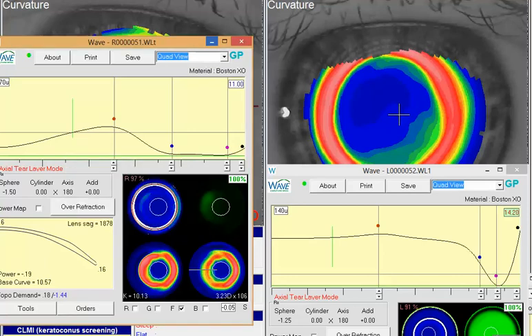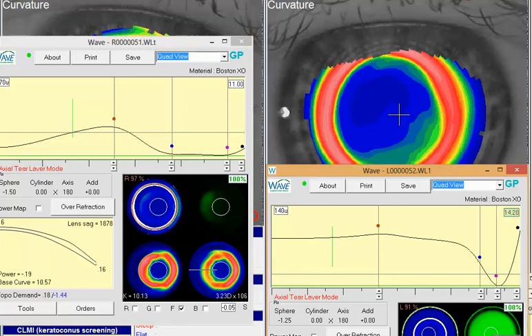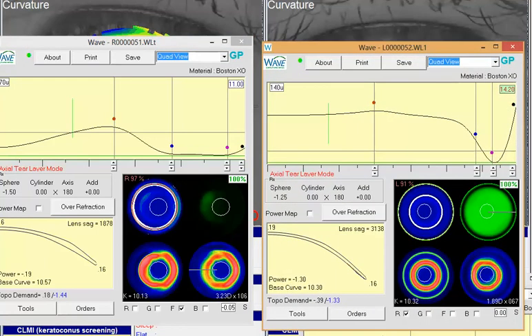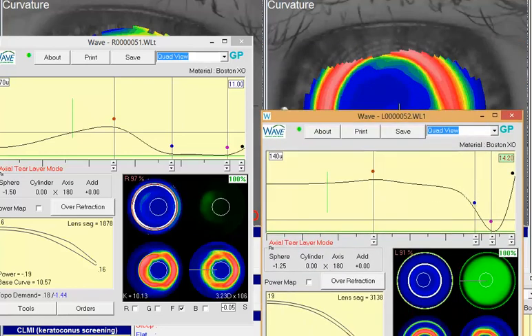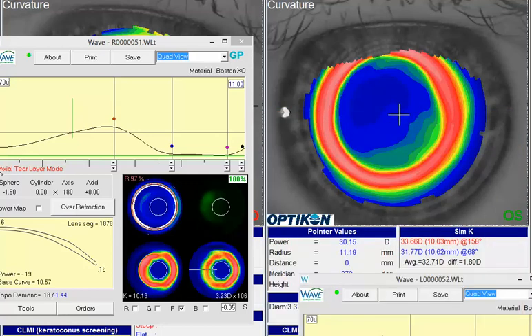Same thing with the other eye — if we look over there. Again, very nicely designed scleral lens here, but as you know, you're getting some cylinder over-refraction on this patient. I tend to find it a little less predictable when I try to put a sphero-cylinder over-correction into these scleral lenses. I tend to find I'm a little more comfortable with it on a corneal design.